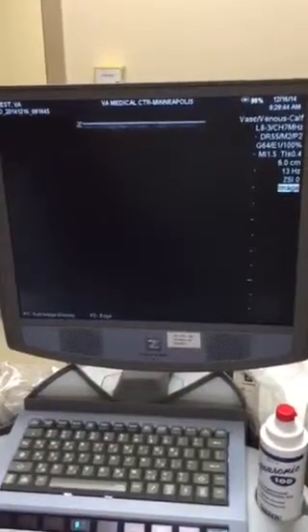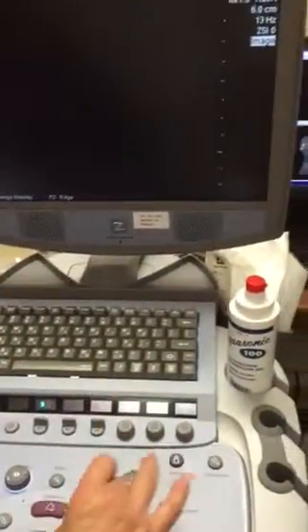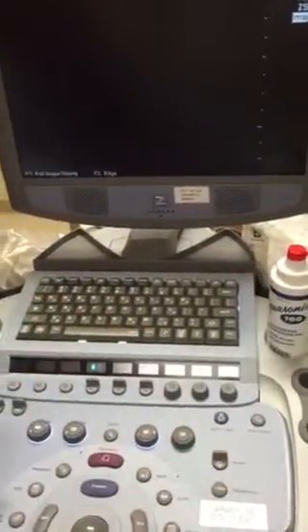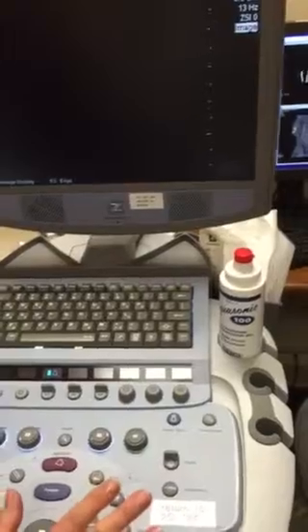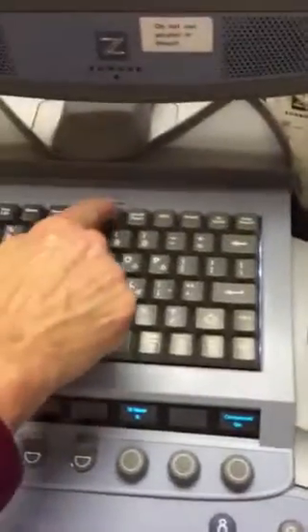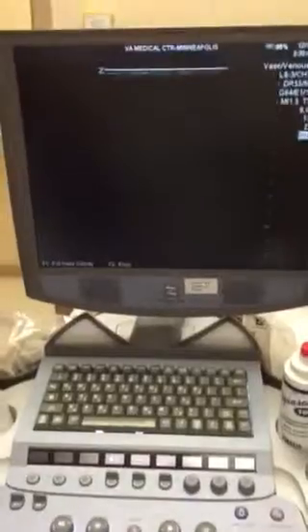Okay, so let's say you have taken the pictures that you wanted, and now you're done with the test. You need to end the exam. There's an end exam button up here. Push that. Do you want to close it? Yes, I do. Set. It's closed.